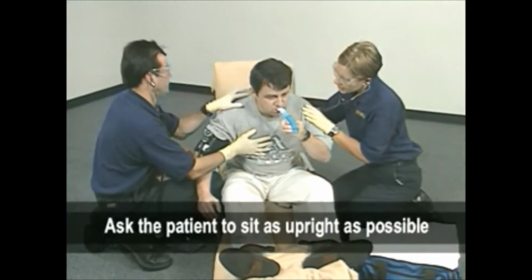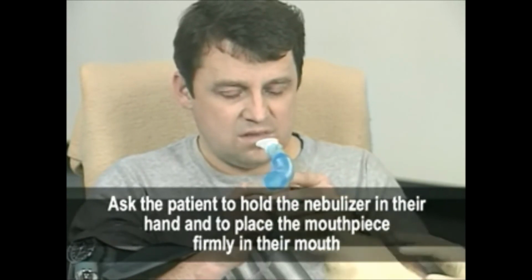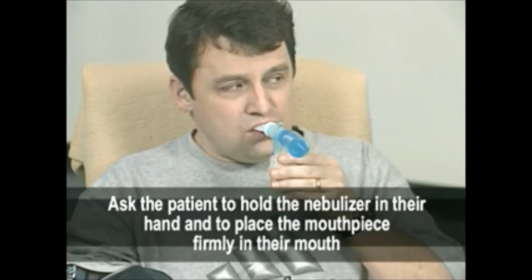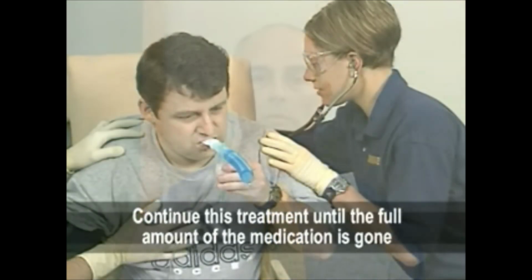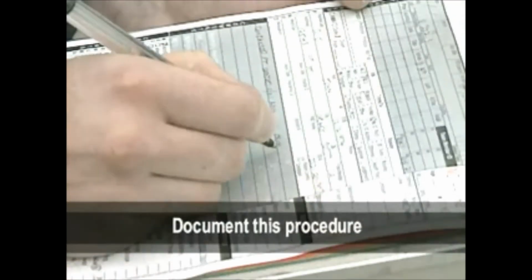Ask the patient to sit as upright as possible. Ask the patient to hold the nebulizer in their hand and to place the mouthpiece firmly in their mouth. Lips should be sealed tightly around the mouthpiece. Ask them to breathe deep and slowly through their mouth. At times it may be necessary to shake the chamber slightly to remove medication attached to the wall of the chamber. Continue this treatment until the full amount of the medication is gone. Document this procedure.